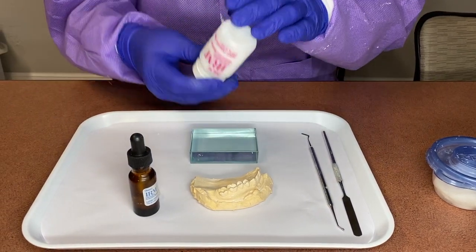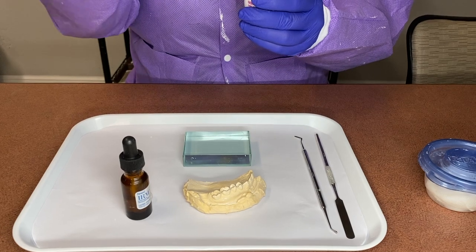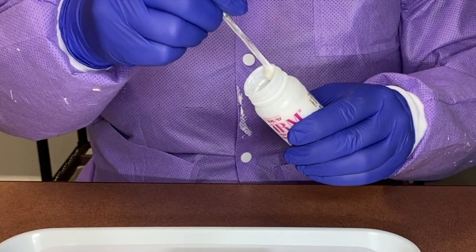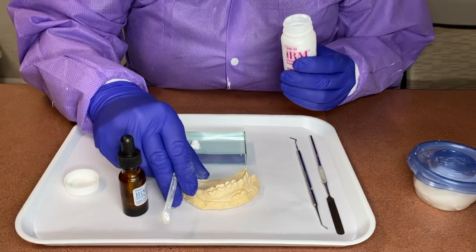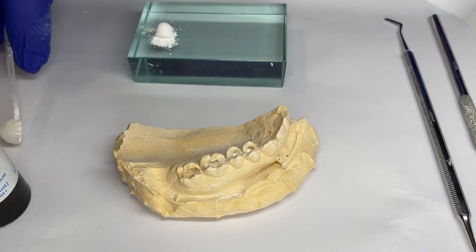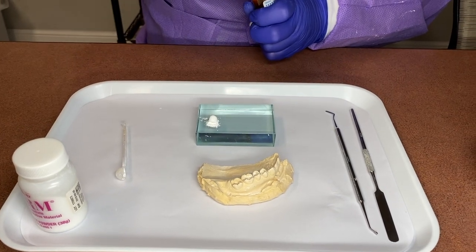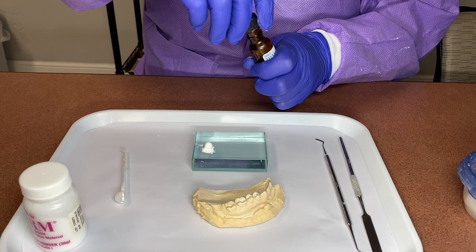So after we fluff the material, we're going to just open it. Always make sure your mask's on because a lot of the fumes come out from the powder. We're going to take this and just wipe it off on the side. I'm just going to put one over here. It's got a small prep in there, so I don't want to use too much material. I'm just going to put this over to the side. Always close your materials after you're done with them so they don't leak or fall over and get everywhere or wasted.